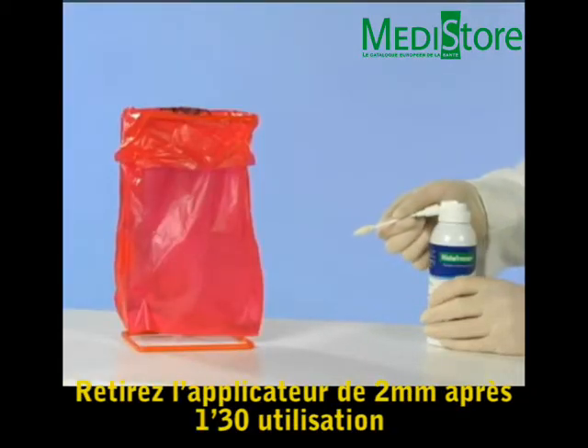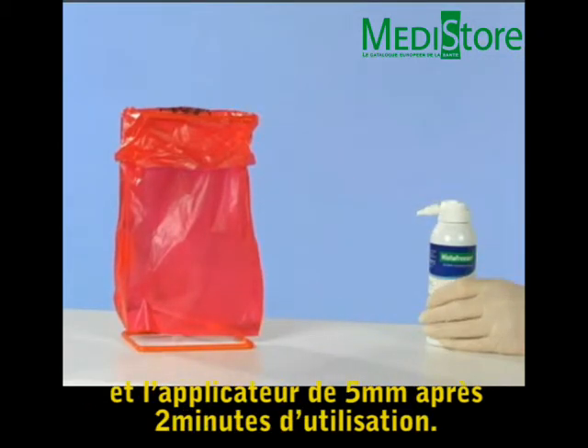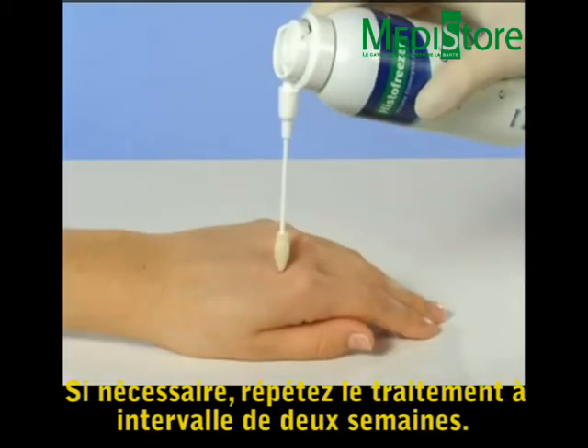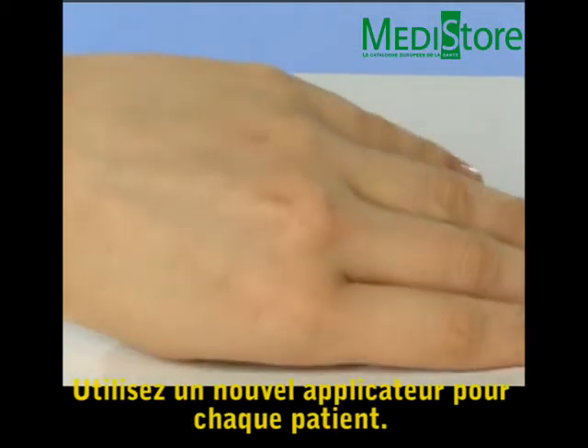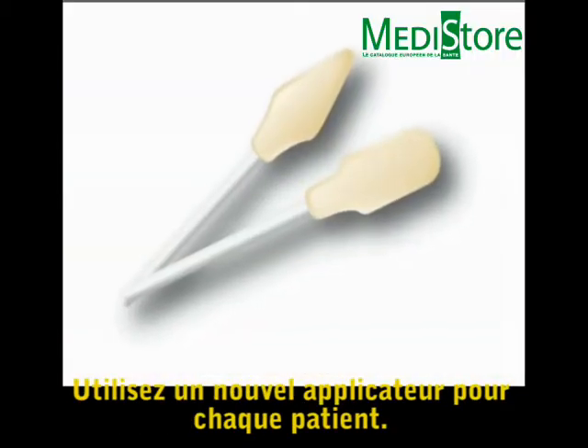Discard the 2 mm applicator after 1½ minutes of use and the 5 mm applicator after 2 minutes of use. If necessary, repeat the treatment at 2-week intervals. Use a new applicator for each patient.